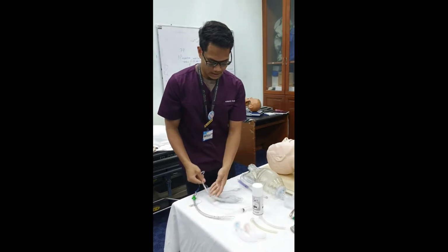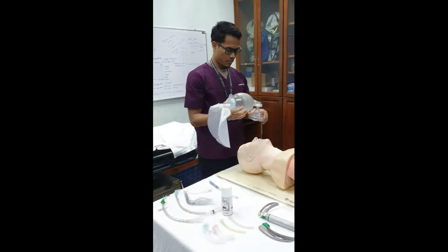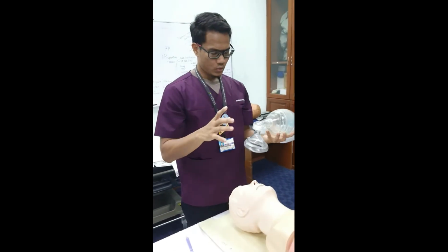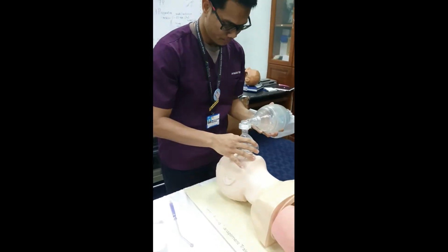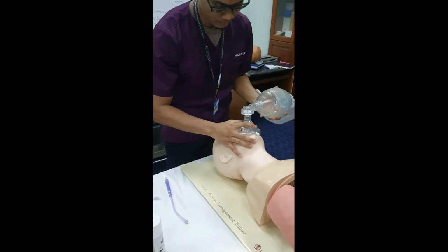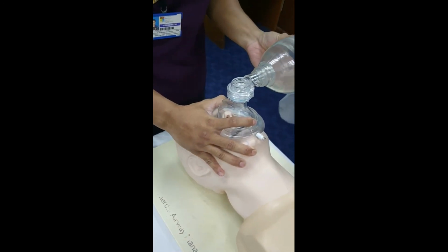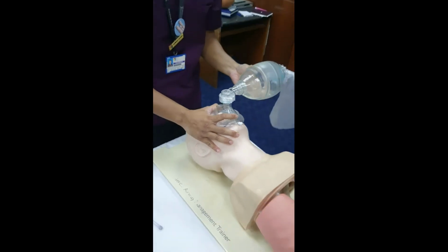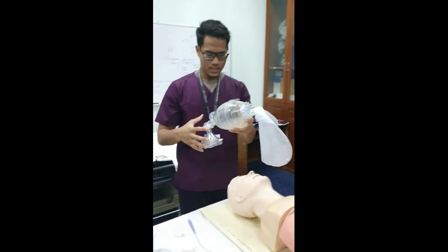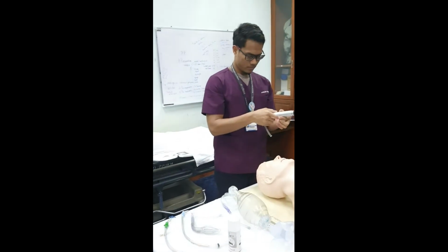When the equipment is ready, before we intubate the patient, we need to pre-oxygenate the patient. So we must put our hand into a C and E shape and fully cover the nose and the mouth. If the patient is not breathing, we can assist the patient's breathing. That's how we do it. When the oxygen has reached 100%, we can start to intubate the patient.